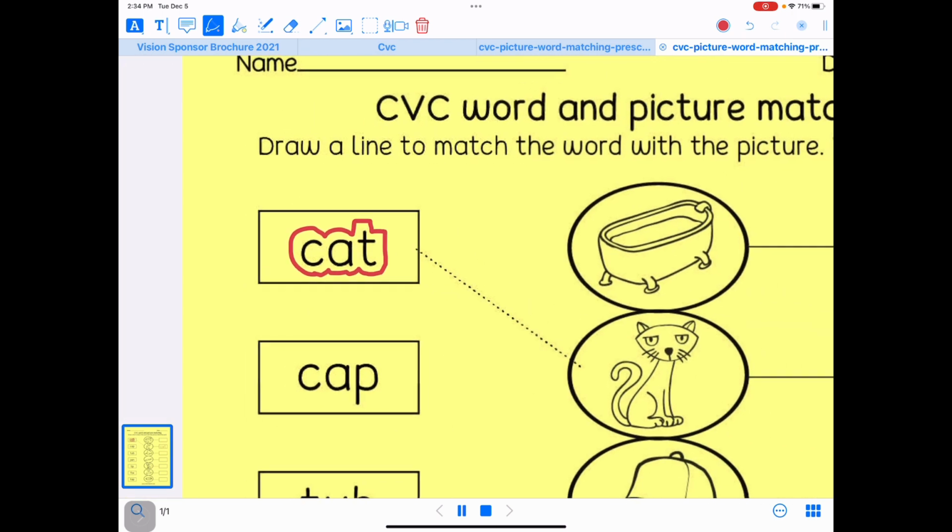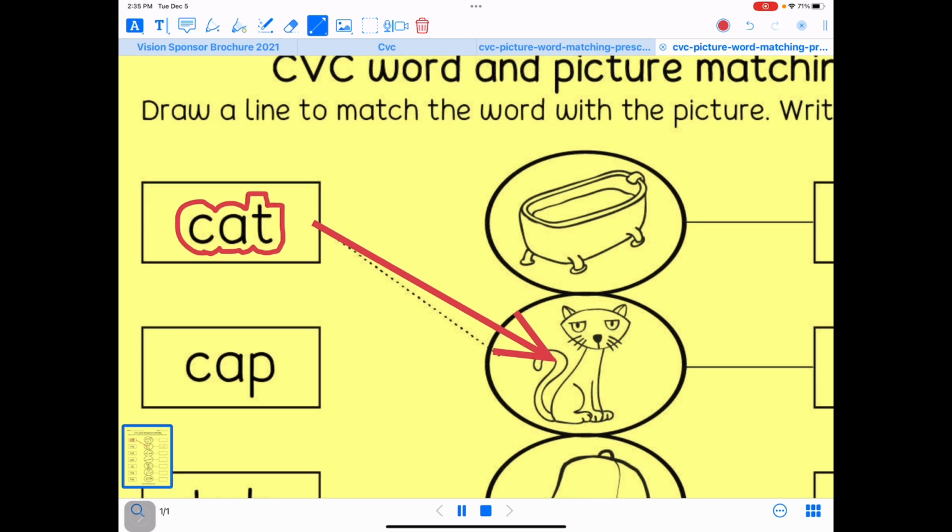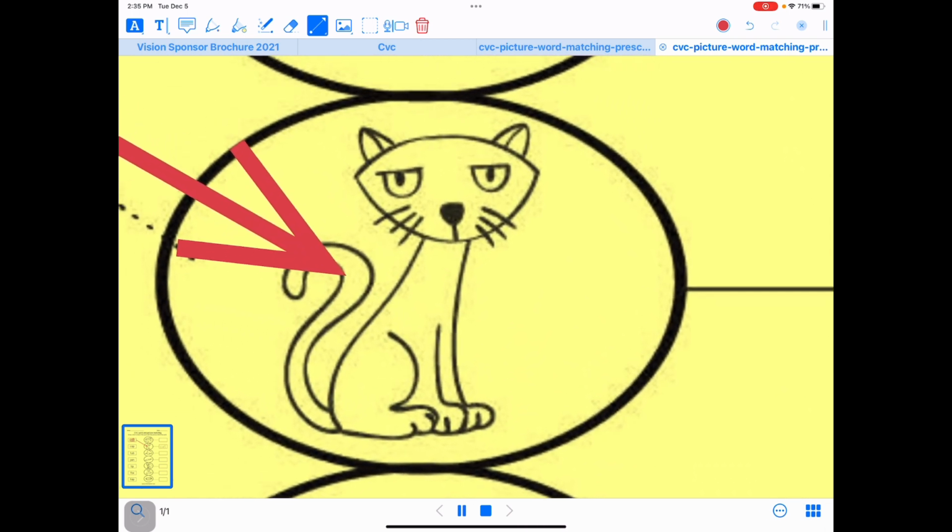So let me show you that arrow tool. If you said they recognize the word and you said draw a line to the cat, and if they're able to do that, you can choose the arrow button. And no matter what their motor ability, maybe they're wiggly and everything, but they get it to the cat and let go, it draws a nice straight arrow. Maybe this cat isn't very visually accessible to your student, so you've zoomed in on it. Maybe that helps. Maybe they still don't recognize it as a cat.